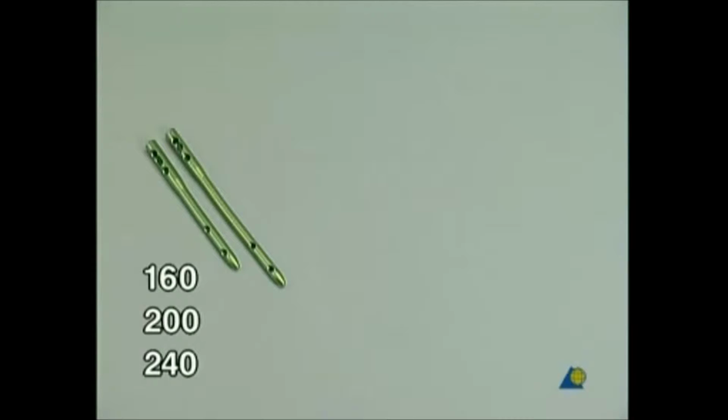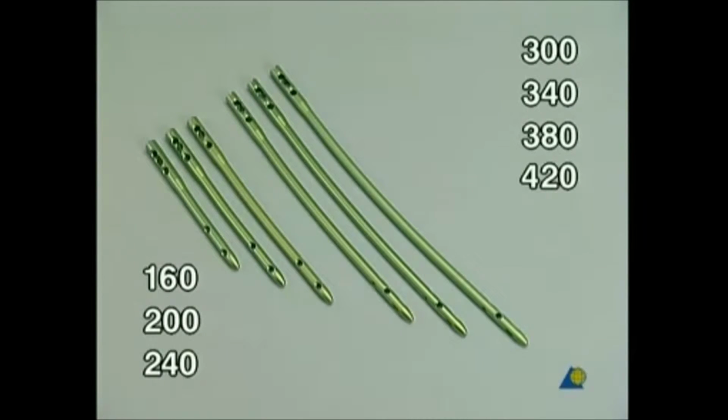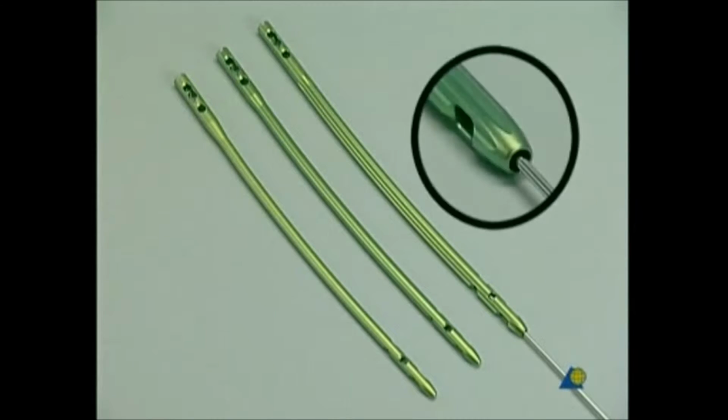The DFN is available in a short version with a length of 160, 200, or 240 millimeters, and in a long version with a length of 300, 340, 380, or 420 millimeters. It comes as a solid nail with a diameter of 9 or 10 millimeters, or as a cannulated 12 millimeter nail.